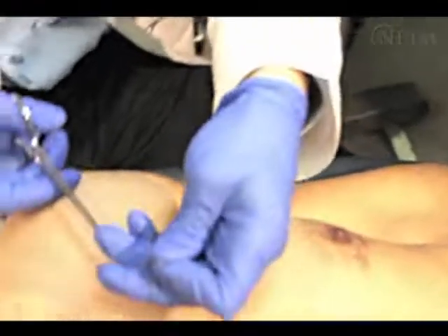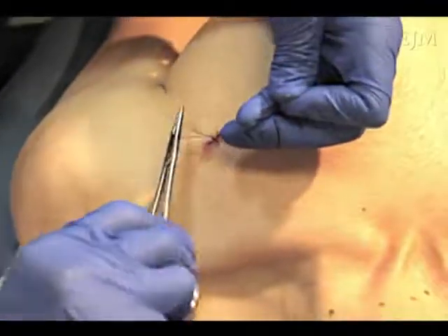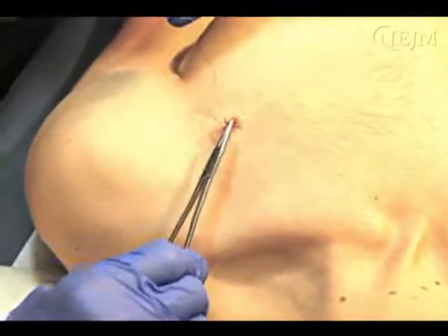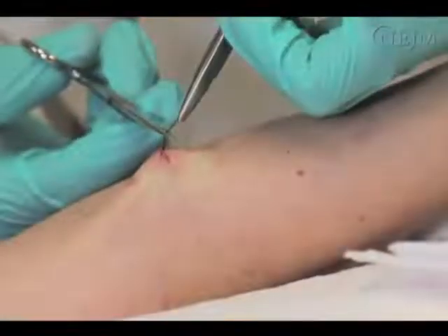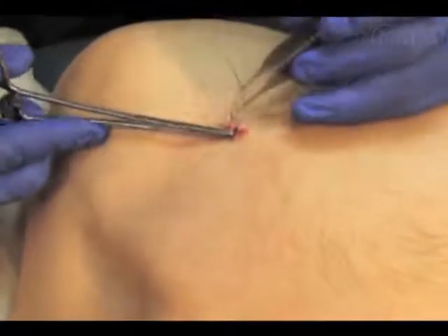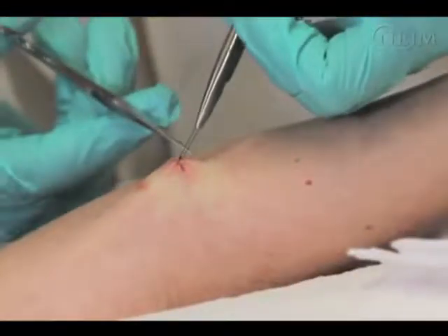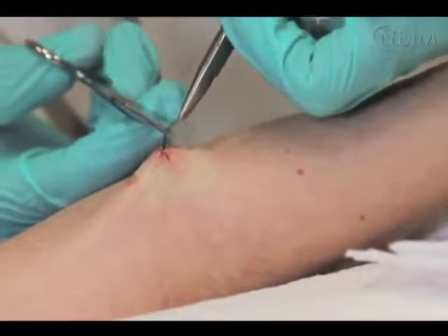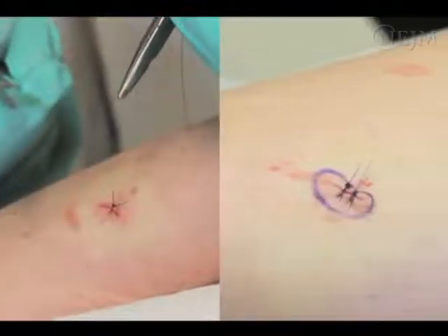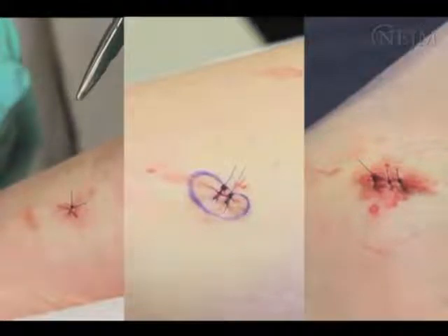Next, spool the suture. Secure the first part of the knot, blotting any bleeding when necessary. Circle the suture in the opposite direction once and cinch a square knot. Repeat these steps for a total of three times, then cut the suture at about one centimeter. Place one, two, or three simple interrupted stitches depending on the size and location of the defect. For an area measuring less than three millimeters in diameter, a single stitch is sufficient. For an area measuring four to five millimeters, place two simple interrupted stitches. Place one more stitch for every one millimeter increase in size thereafter.